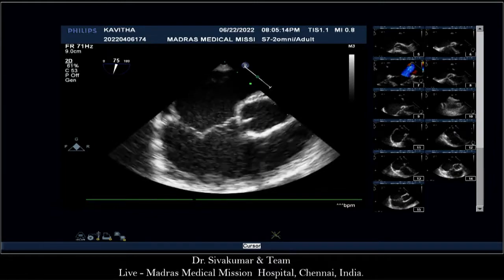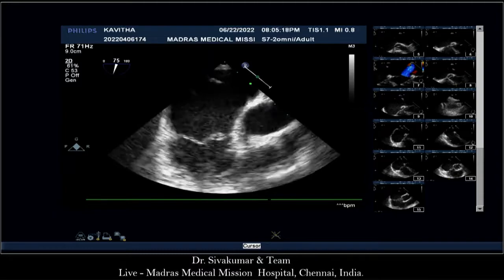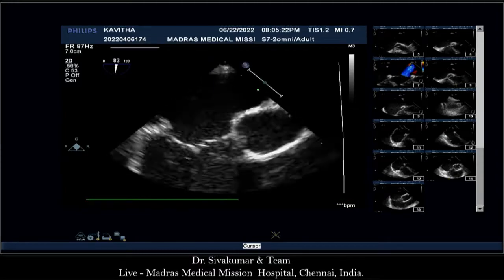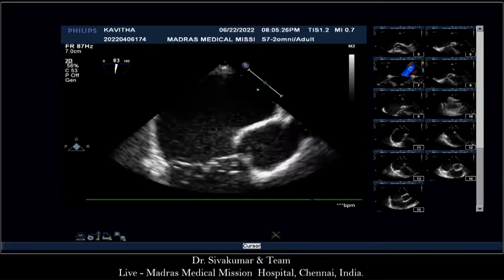Can I just ask, it's Iqbal here, can I just ask a question? Can you just do that measurement again? I was interested to know where you measured to. Is this an offset septum? Because you measured off where I thought you might. Yes. Actually, yeah, sure.